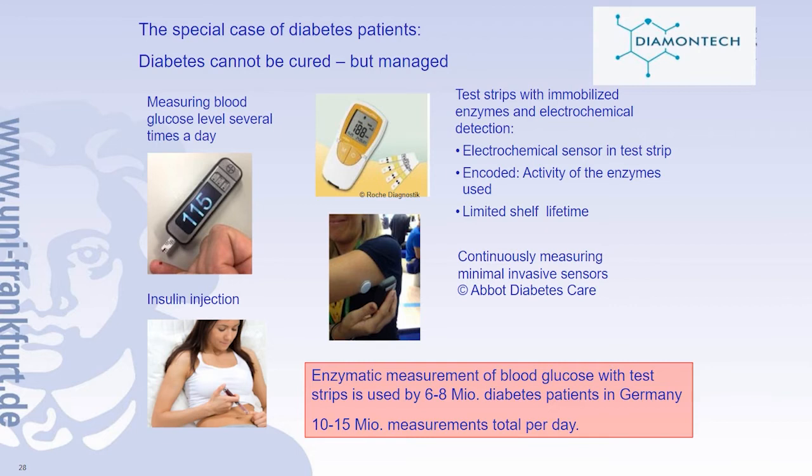The problem is that too many people worldwide cannot afford those continuous measuring sensors, and thus they have to rely on the test strips.